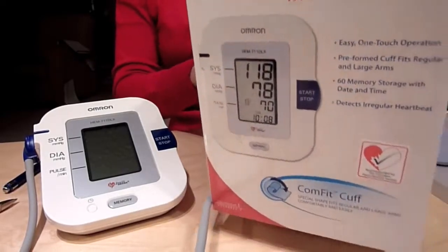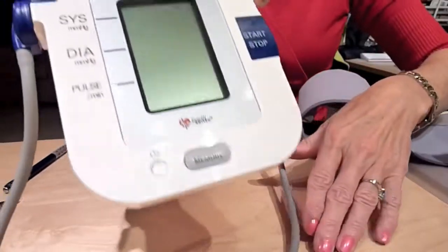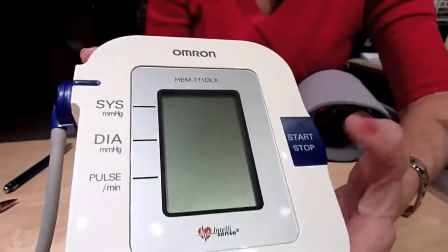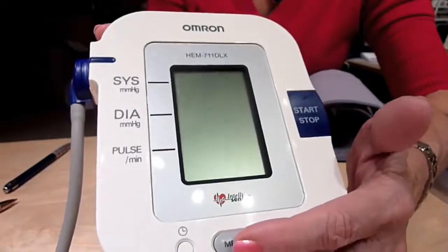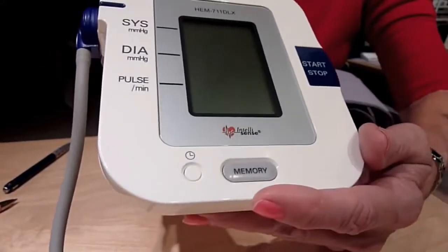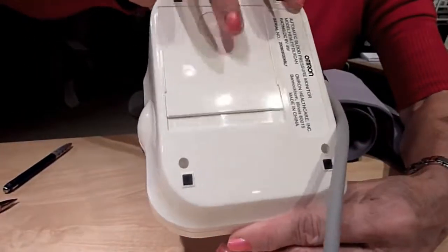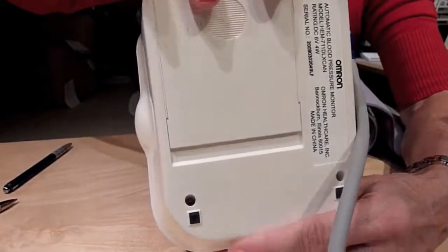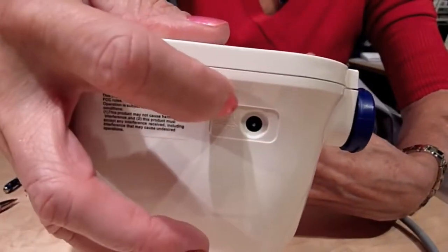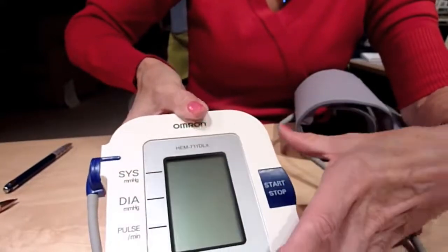Here is the case box for it. Here is the monitor and the base. It has the on-off button, a memory button, and you can scroll through the memory — it holds about 30 readings. On the back, it takes 4 AA batteries, or it also comes with a plug so you can plug it in and take your power from the wall source.